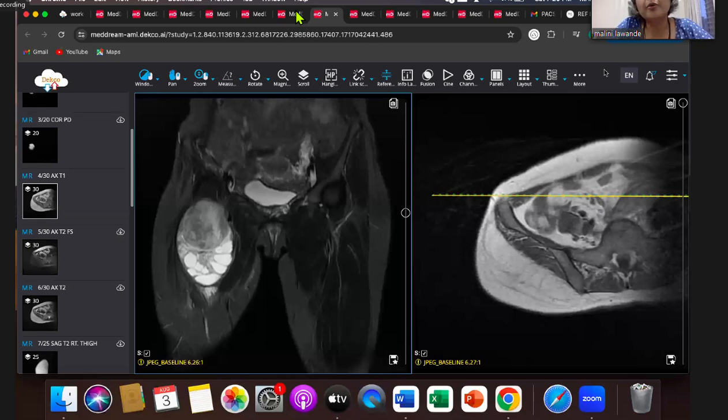There is a whole group of radiologists in UK who, in fact, do not give contrast at all in any of the tumor cases, and they do plain scan. We like to give contrast to look at these enhancing areas and delineate them better.